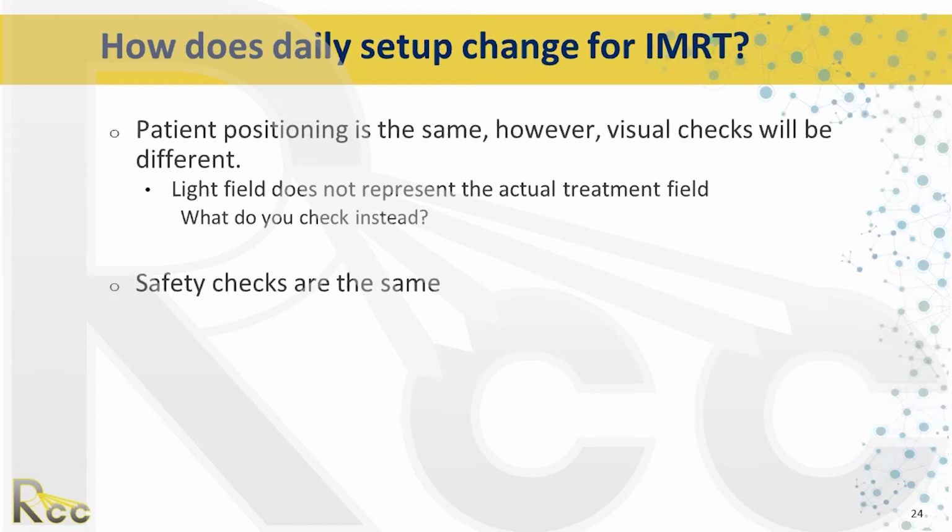So just make sure whether you're going to the ISO mark or you're doing your shifts, you're reconfirming that this is the correct body part. This is what we're treating. And that makes sense. That's where the lasers are at. You're still going to make sure everything clears, check for clearance, any kind of collision avoidance.